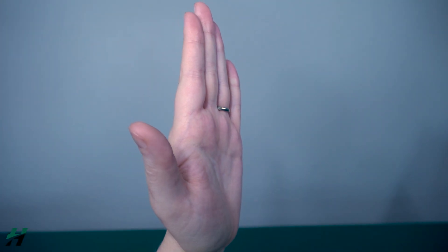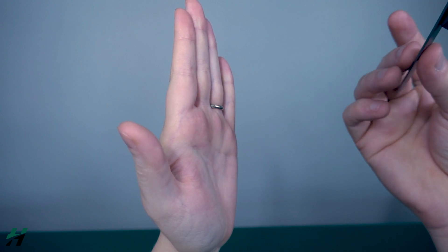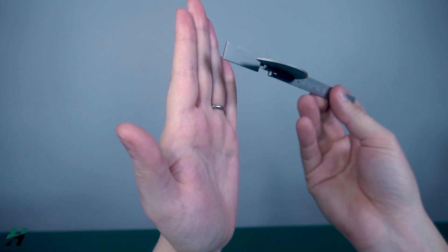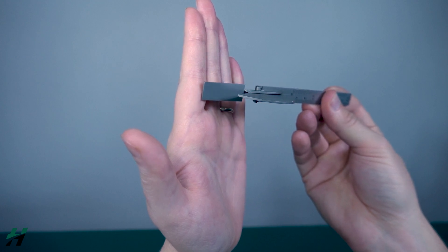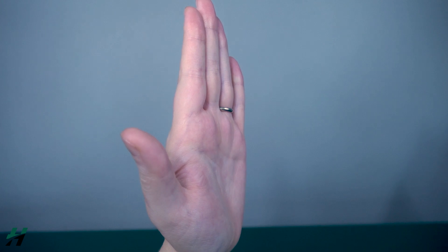Measuring MCP hyperextension: once again, patient position will be seated with their elbow resting on a table or solid surface with their hand extended upward. Just like flexion, you're going to measure with your goniometer stationary arm on the desired metacarpal, the axis on the MCP joint, and the movement arm on the proximal phalanx.